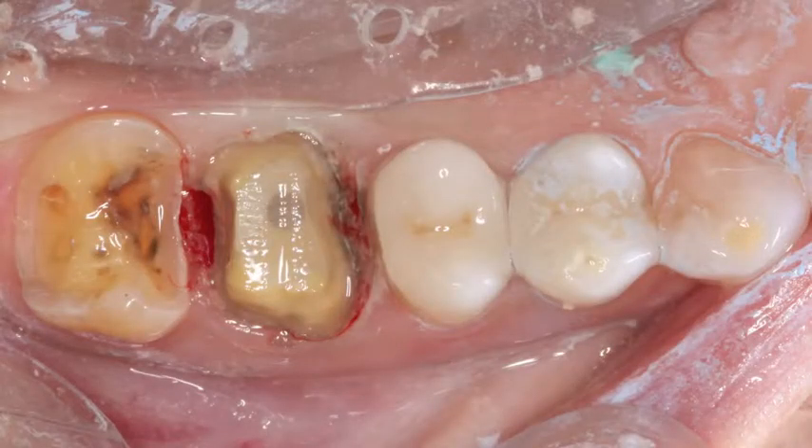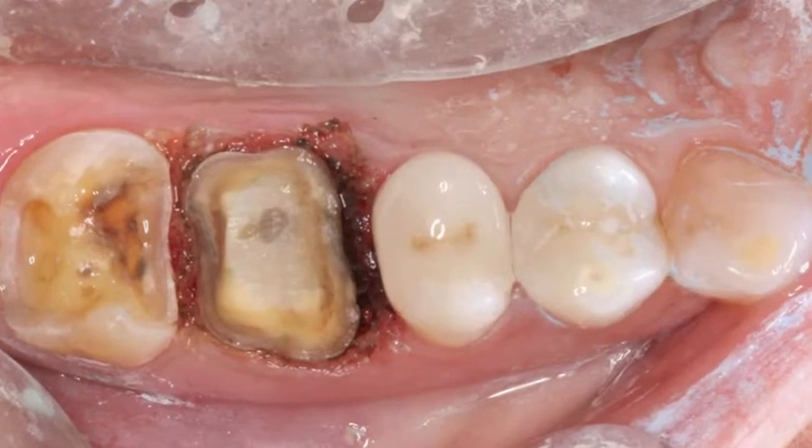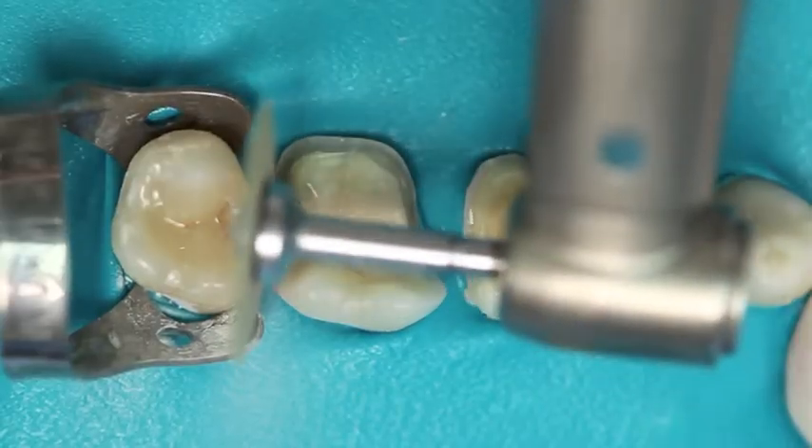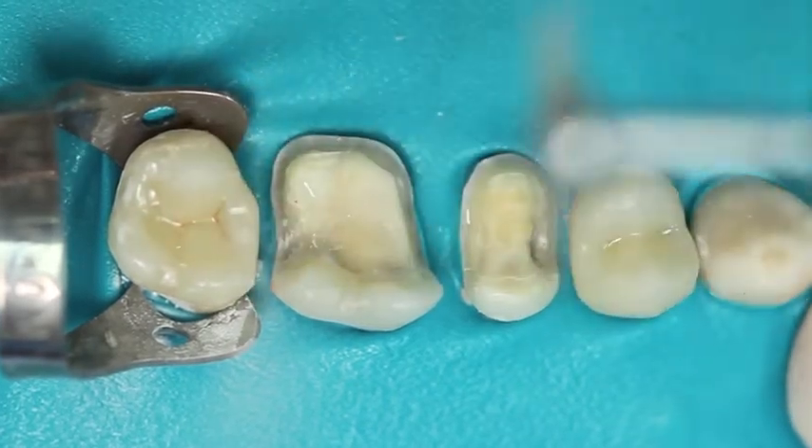They all dropped in. Some of the margins were way subgingival — we used our laser to expose those margins. I used contrast spray, which is one of these new reflective mediums in a can — it's more like a varnish, which allows me to capture a very clean, crisp margin. I make sure that my proximal contacts are prepared, so I'll do enamelplasty where I need to, to make sure the proximal contact is in the same alignment with the prep.